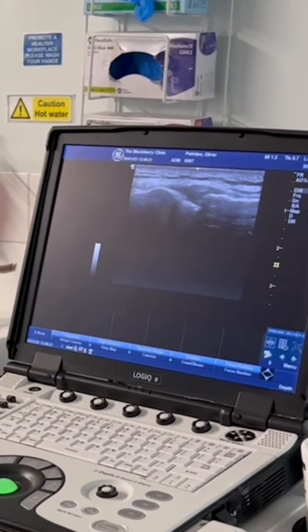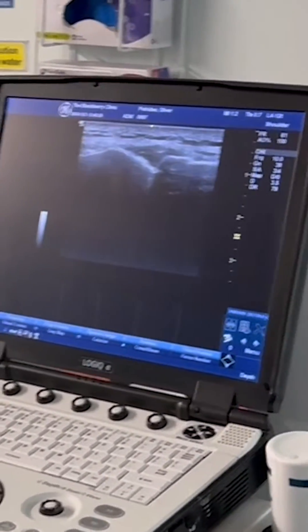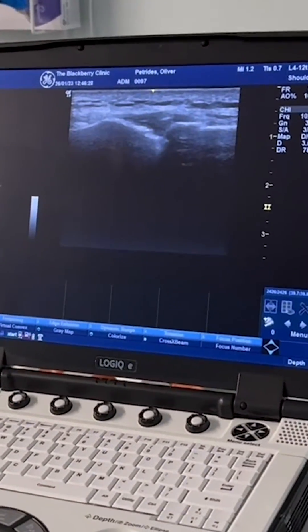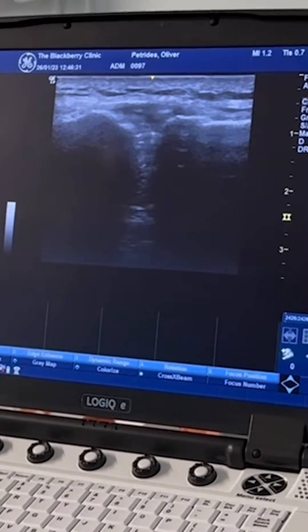Here I'm carrying out an ultrasound-guided injection of some cortisone with anaesthetic, and on the image I'm looking at the needle.